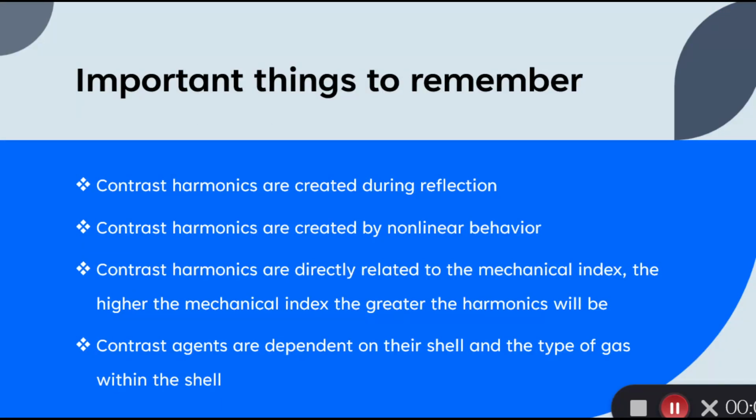Important things to remember from this presentation are contrast harmonics are created during reflection. Contrast harmonics are created by nonlinear behavior. Contrast harmonics are directly related to the mechanical index. The higher the mechanical index, the greater the harmonics will be. The lower the mechanical index, the lower the harmonics will be, or no harmonics will be created. Contrast agents are dependent on their shell and the type of gas within the shell.